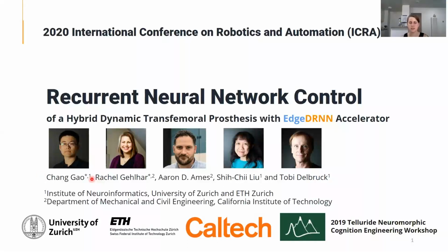And today we are presenting on recurrent neural network control of a hybrid dynamic transfemoral prosthesis with EdgeDRNN Accelerator.